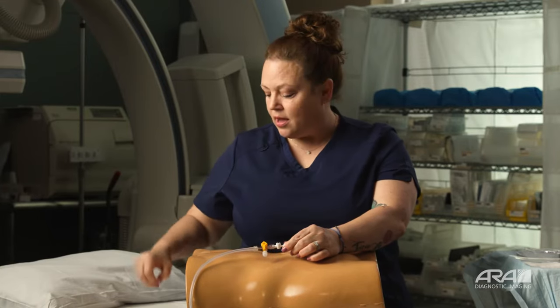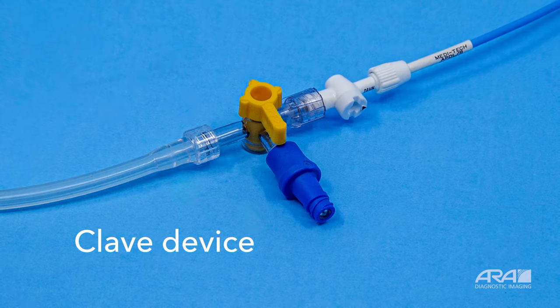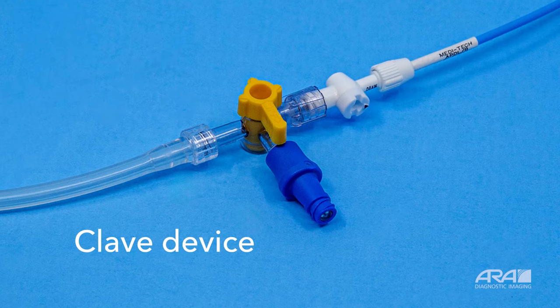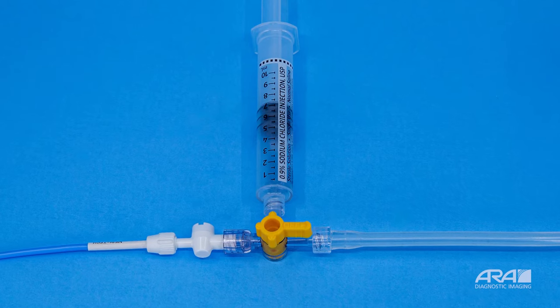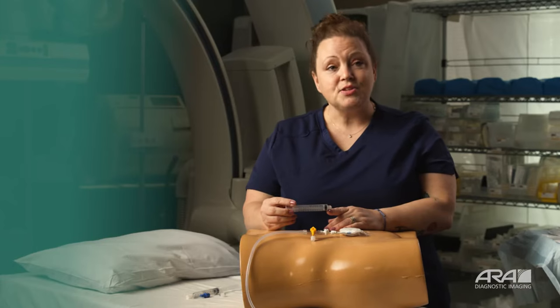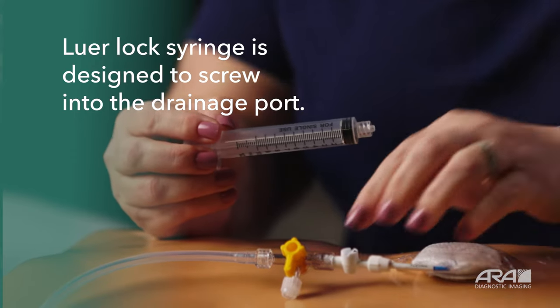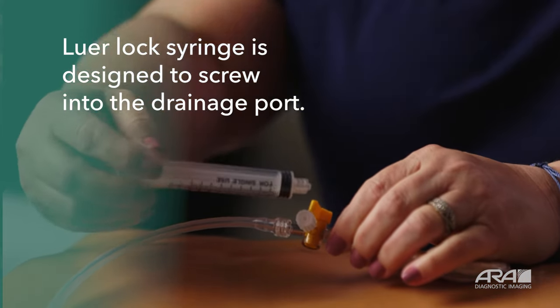The three-way stopcock may have another piece of equipment attached as well. Some doctors will attach this blue clave device. This device is going to connect where you will flush your tubing. This works the same way the access port works on the three-way stopcock. Both of these will accommodate a luer lock syringe. When you go home with your new drainage system, you'll go home with a syringe that will help you clear and flush your device. This syringe is called a luer lock syringe — it is made so that it screws into the flush port and closes firmly.